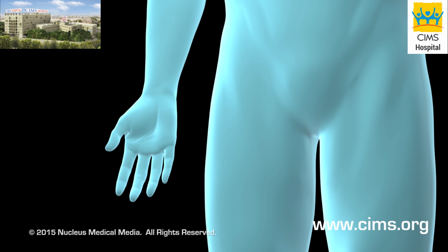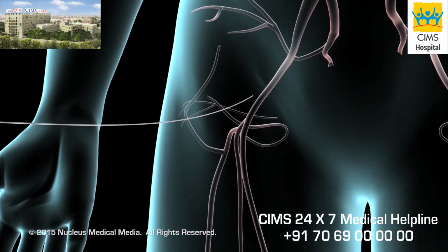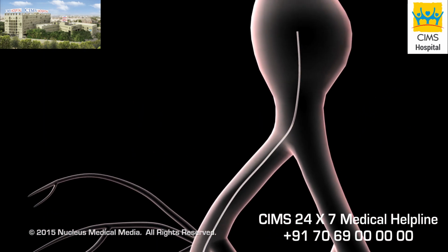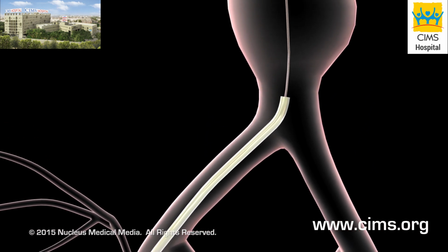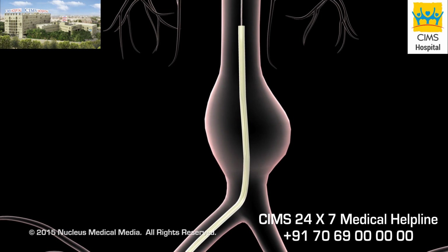Your surgeon will begin by making a small incision in your groin over your femoral artery. Then he or she will insert a guide wire into the artery and gently push it up toward the site of your aneurysm. A catheter, or hollow tube, will be passed over the guide wire and pushed toward your aneurysm.